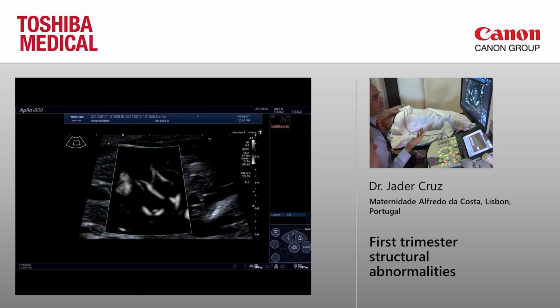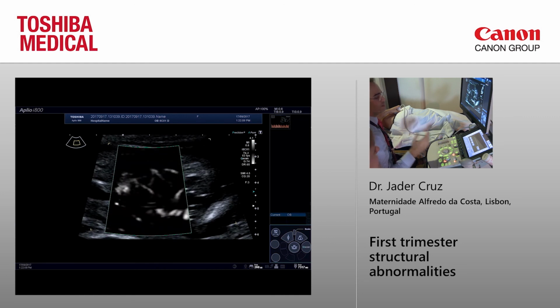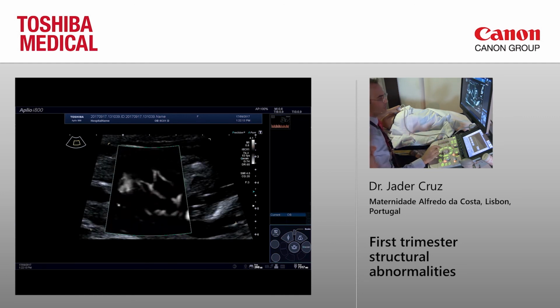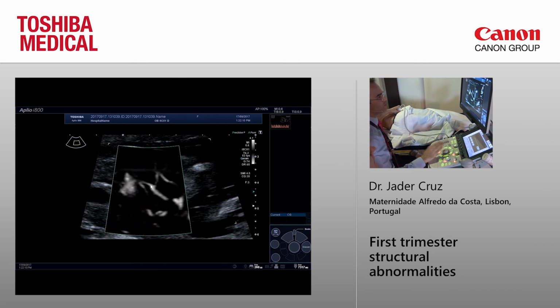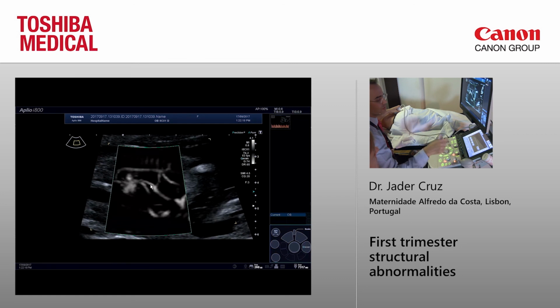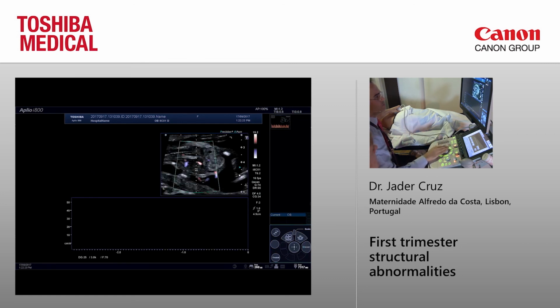You see, it looks like you like it, isn't it? But I like to measure. Of course, you can see that with the SMI, you can see where to place the caliper. You see the ductus venosus there. You don't really need to rely on the aliasing. So then you just measure that.